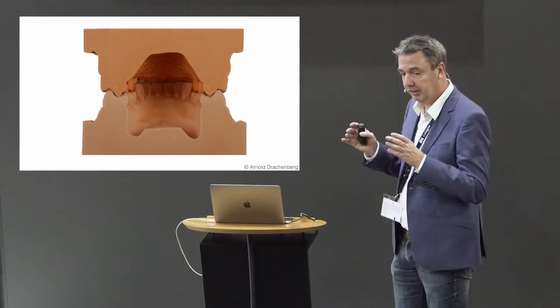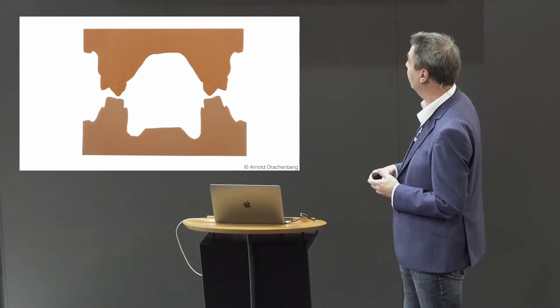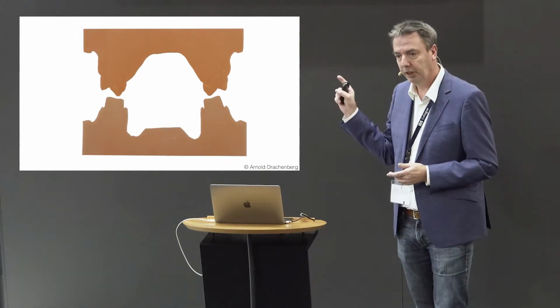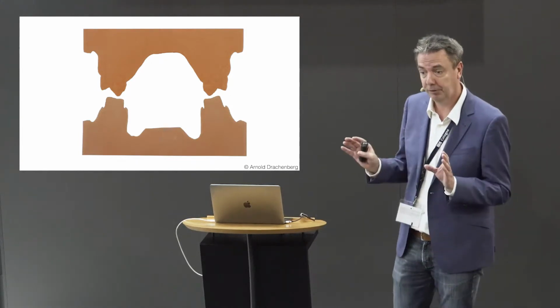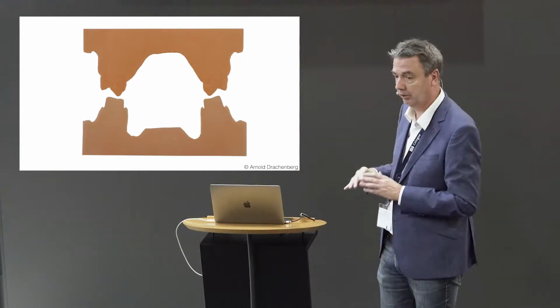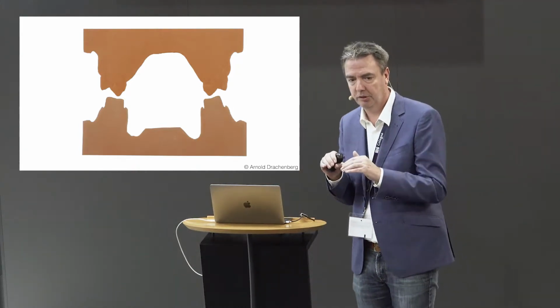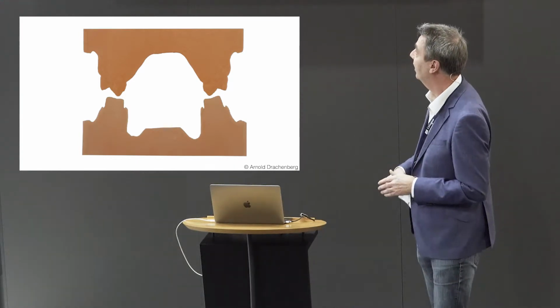This is the situation before we start the preparation, and then this is the prep case, and if we judge this in the mouth of the patient, it looks perfect. There's enough space. This is what we normally think before we take the impression. Everything is fine. The occlusal reduction is totally okay, but it isn't.